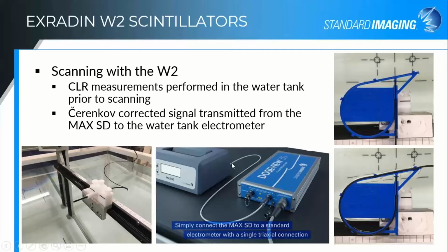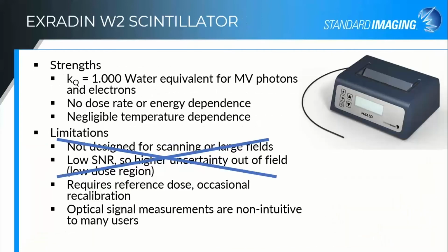We do apply a gain to the signal so that it's in the range that your water tank can measure, but to give you nice, smooth, reliable, repeatable data, it's good to scan slowly. Because this is a small field detector, it really is worth taking the extra time for your small fields to be able to get good scanning measurements.